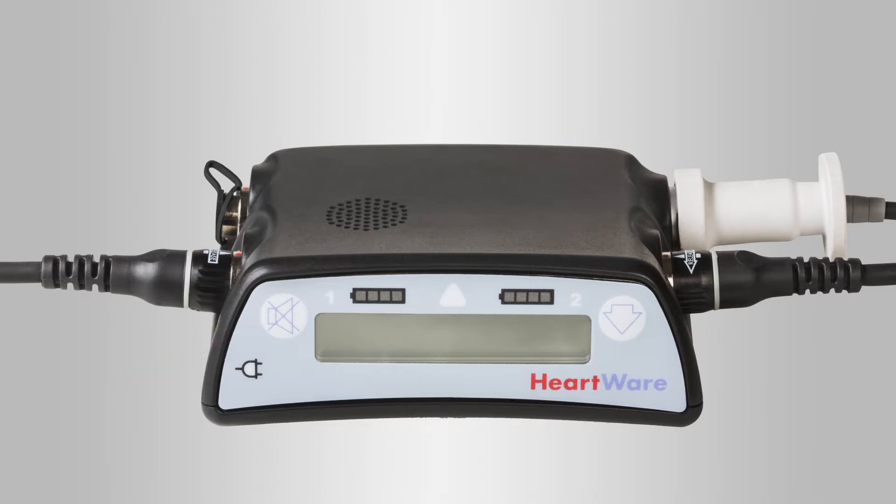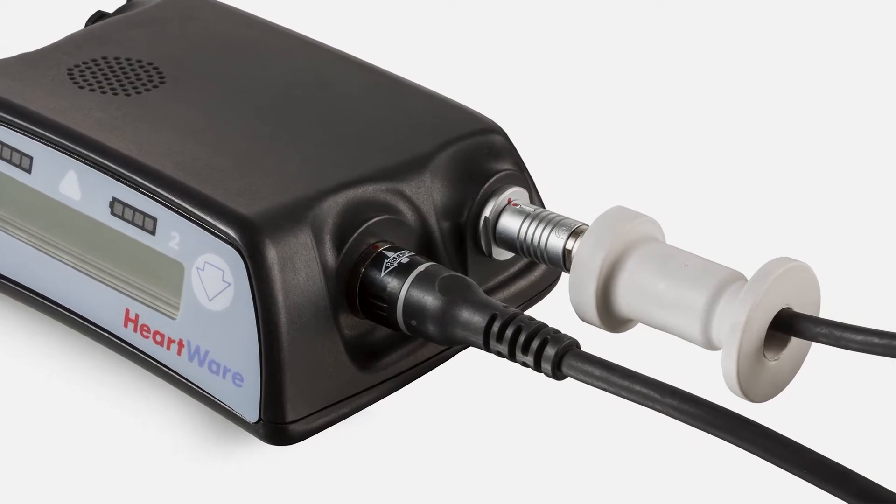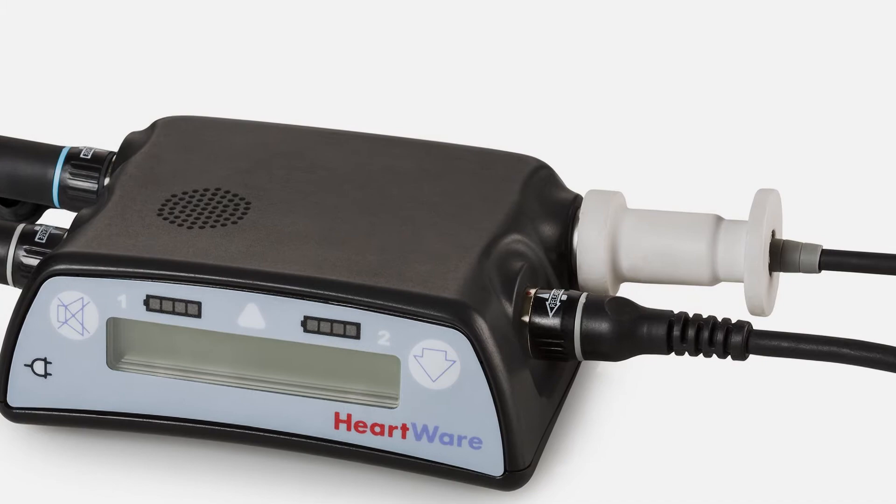There are four connectors on the controller: one driveline connector, two power supply connectors, and one data port, which is also used for the alarm adapter. The silver driveline connector should always have the driveline cover in place. When properly positioned, the driveline connector will not be visible.